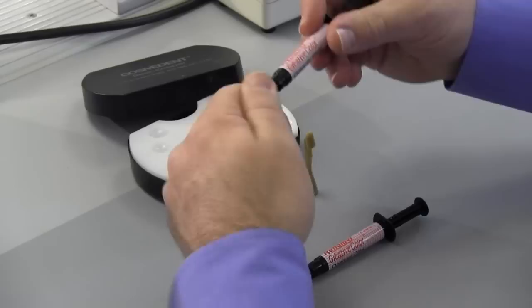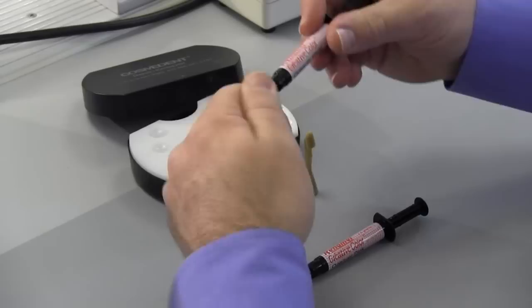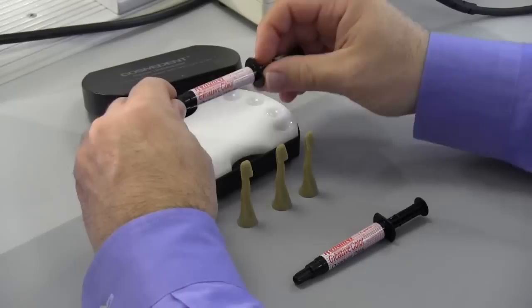We're going to first start by putting our material on our Resin Keeper, which is a nice light-sealed box that keeps the material from setting as you work. You can see we're placing the white opaque first, and then we're going to place the pink opaque right next to it.